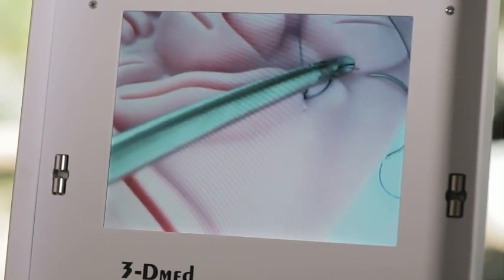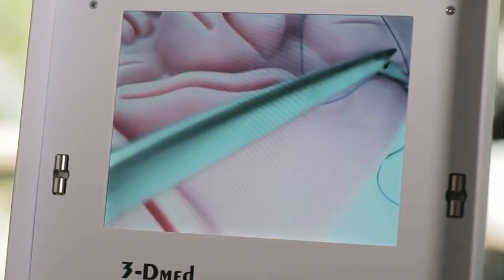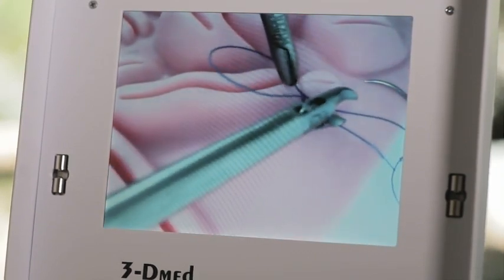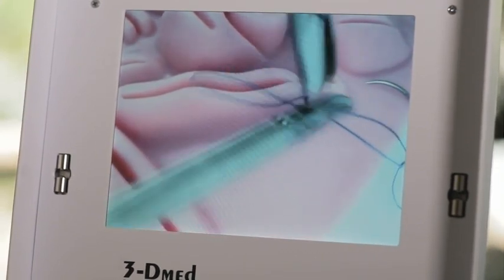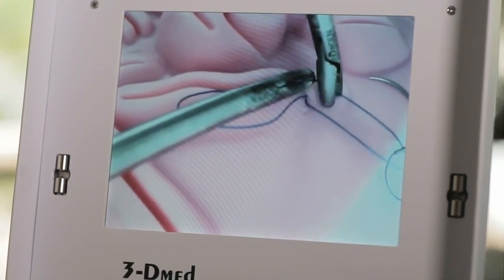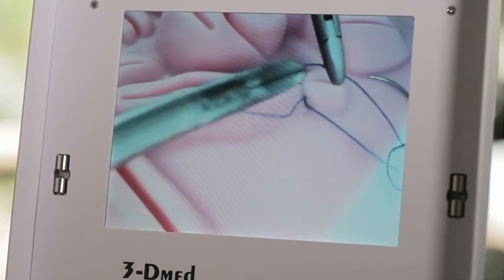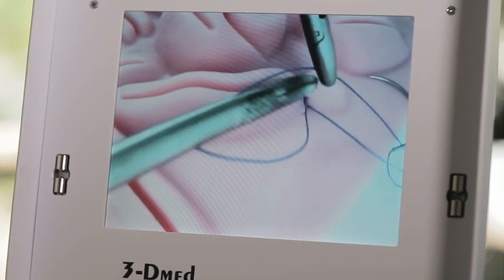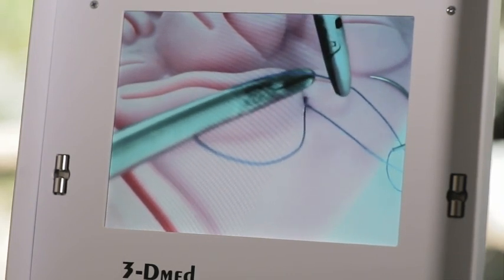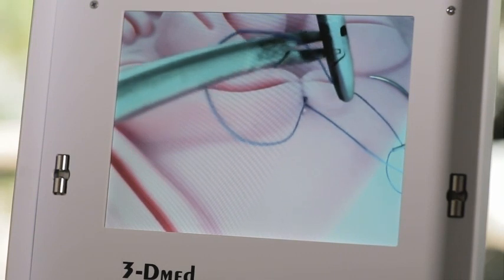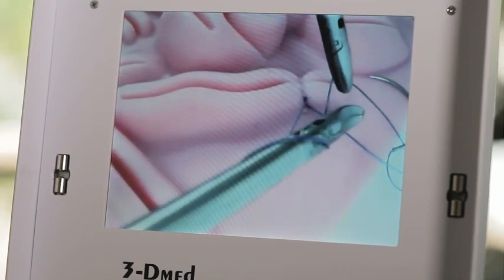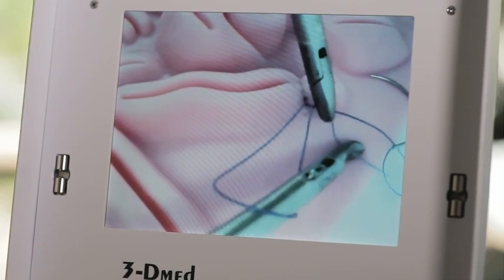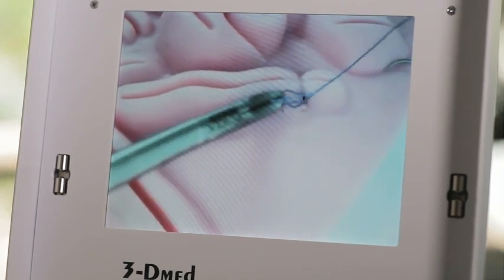I'm going to place the loose end where I want to pick it up. Here's another way to tie a knot. I will hold the suture so that instead of the hub facing me, the suture is coming out perpendicularly from my needle driver. I will wrap, go and get the loose end, and there is knot number two.